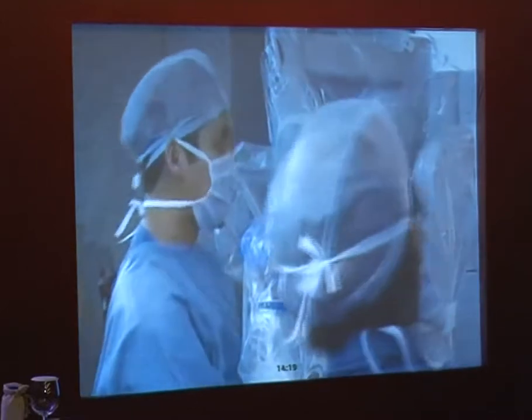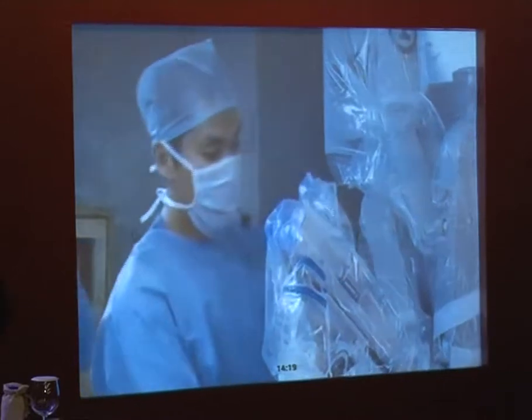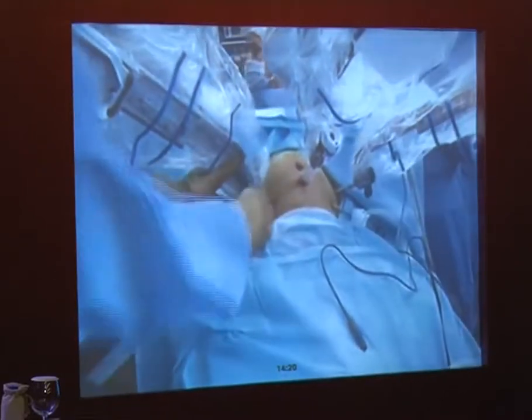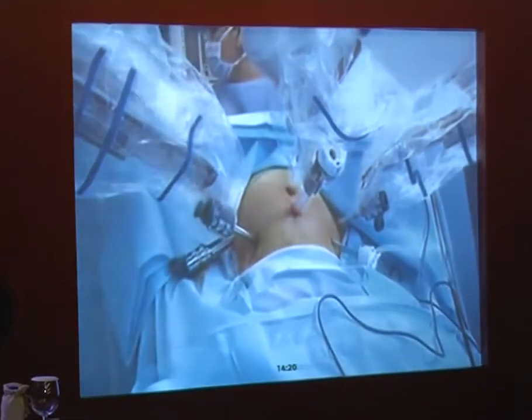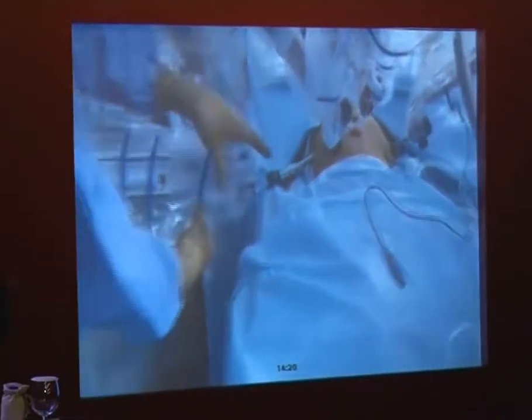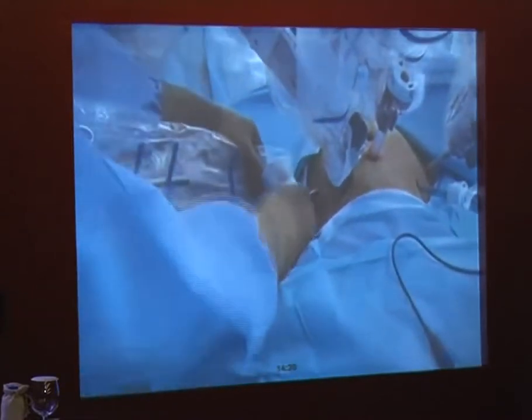Arnie, do you use your fourth arm on the side on which you side dock? If you're docking on the left side, do you use your fourth arm on the left side? Yes, we're using the fourth arm on the patient's left. That's a left-sided dock. Generally, that's what people do. The side that you side dock on, you bring your fourth arm on. If you side dock on the right, that's where your additional operative arm is going to go. That's the rule of thumb for side docking.